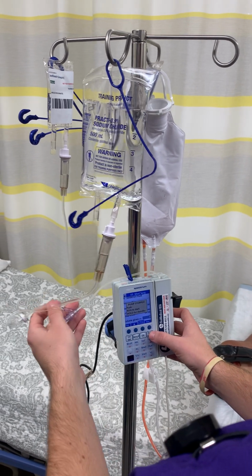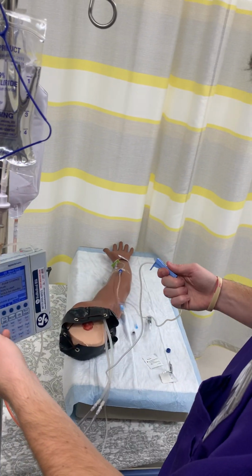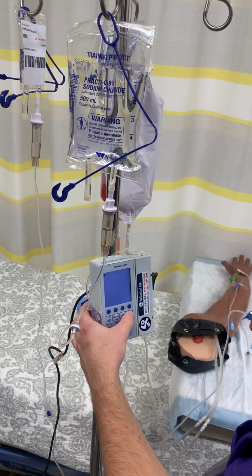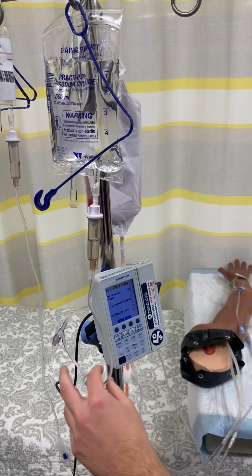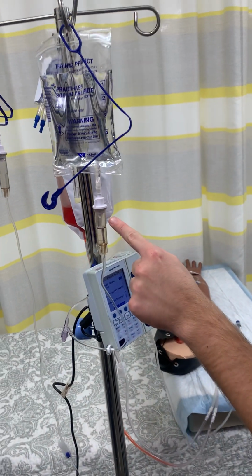So then I'm going to make sure I open this roller clamp. I'm going to push run. Just making sure that there's no kinks in our tubing here. And we're noticing that we see that it's starting to drip.